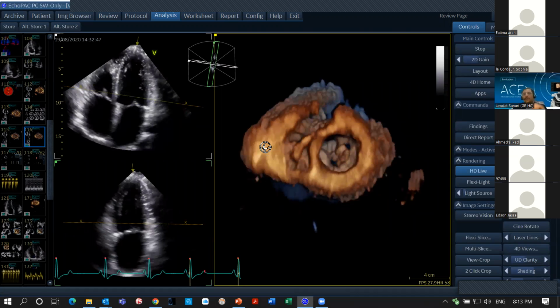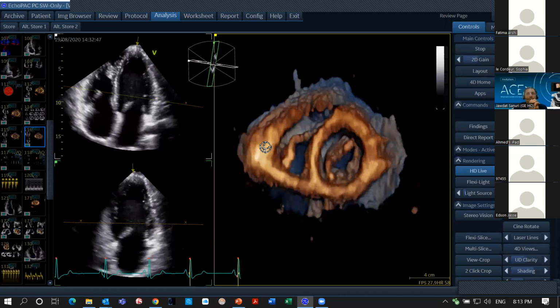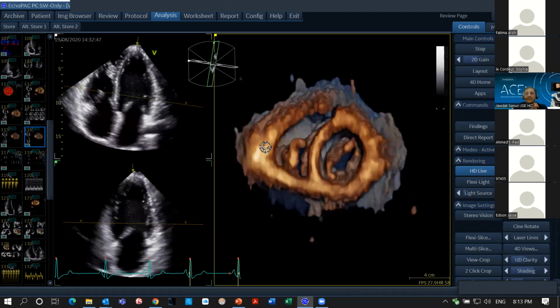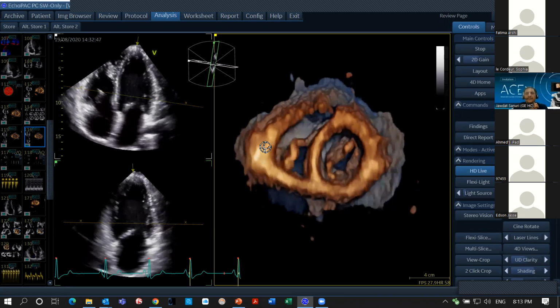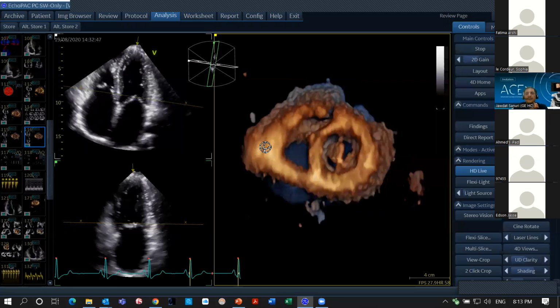But whenever you are using the P2, the image is showing frozen. Why would you not be able to store an image? What do you mean it's not highlighted? Yeah, it's the button. The button light is just not highlighted.